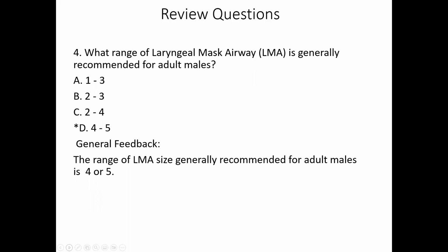Keep in mind one other thing, going back to the preceding slide on ET tubes. If a patient needs to be bronched subsequently, 2 days later, with a 7.0 versus a 7.5, in many cases you can't use a standard bronchoscope on a 7 ET tube. You'll have to use a pediatric one, which won't go as far. So it's about thinking ahead. It doesn't mean you can't or shouldn't use a 7. There's just a potentially big difference downstream when you consider that 10 or 20% of your patients on prolonged mechanical ventilation will need to be bronched in some manner.